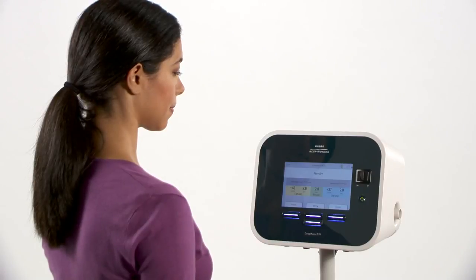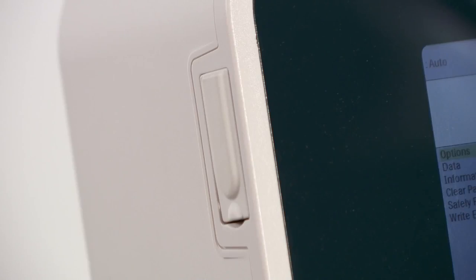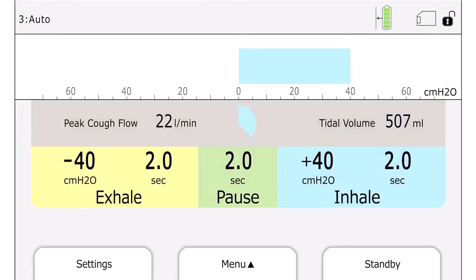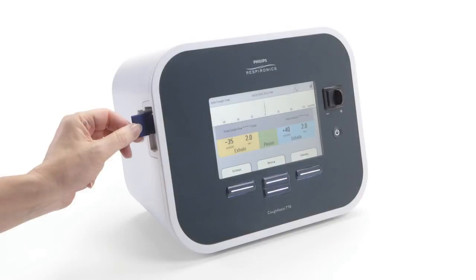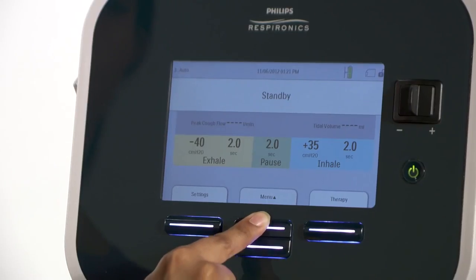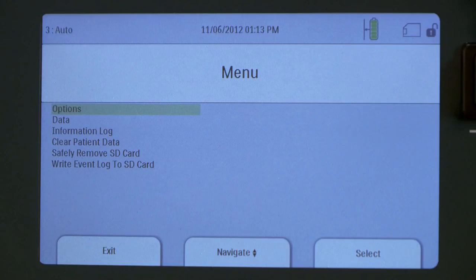CoughAssist T70 comes with an SD card inserted in the SD card slot on the side. An SD card icon will appear on the top right corner of the screen. Your clinician may ask you to remove this card in order to review information about your treatment. From the standby screen, press up on the center button under menu.